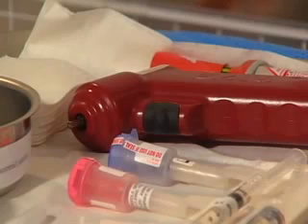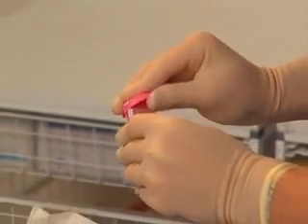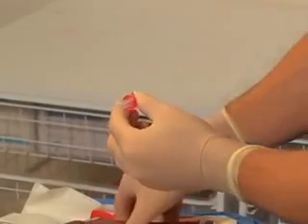Select the appropriate needle size based on the patient's weight. The pediatric needle is designed for use in children weighing less than 40 kilograms, unless large amounts of overlying soft tissue predict the need for a longer needle. Remove the needle from its protective container.